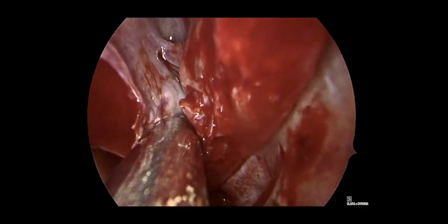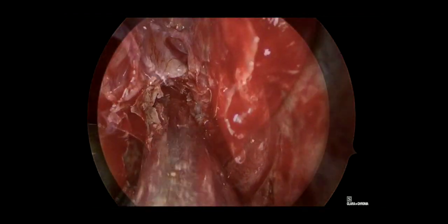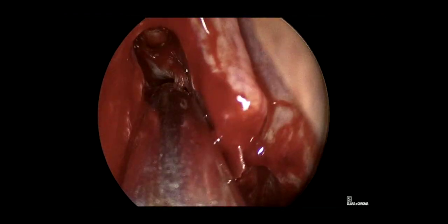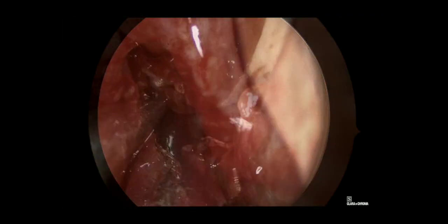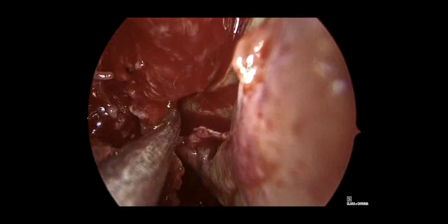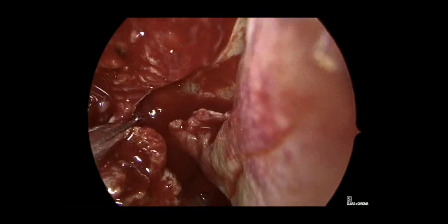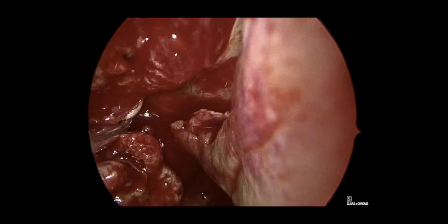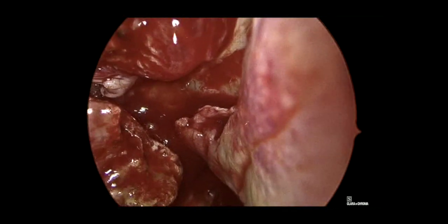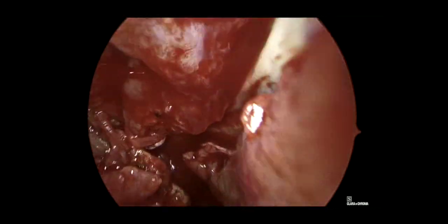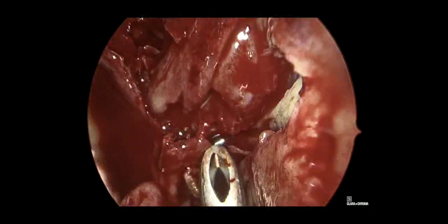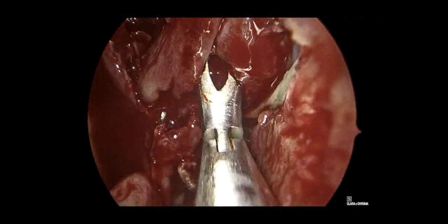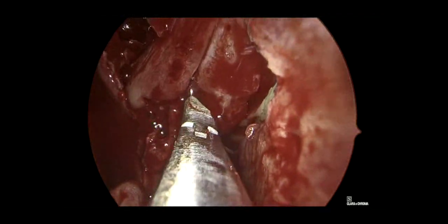After that, we'll go ahead and do our sinus work on the right side. This tumor fairly well respects the middle turbinate and does not go very far laterally. We've completed a maxillary antrostomy and total ethmoidectomy on the right side. Now here we are elevating the tumor up over the choanal arch and beginning to take some tumor out at the base of the sphenoid sinus there and over the choanal arch.